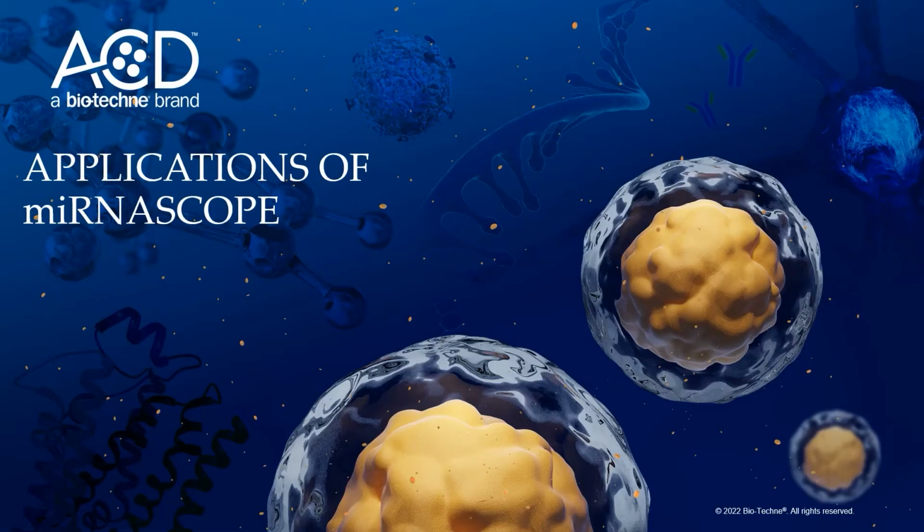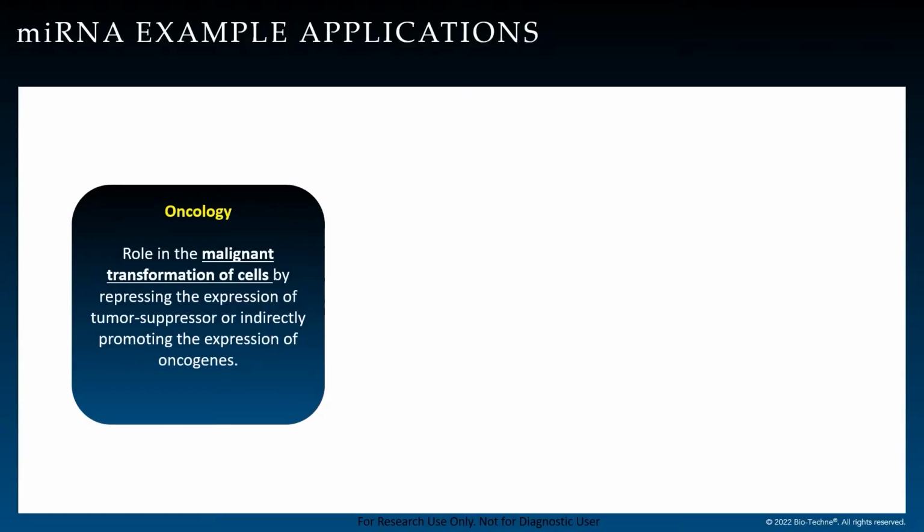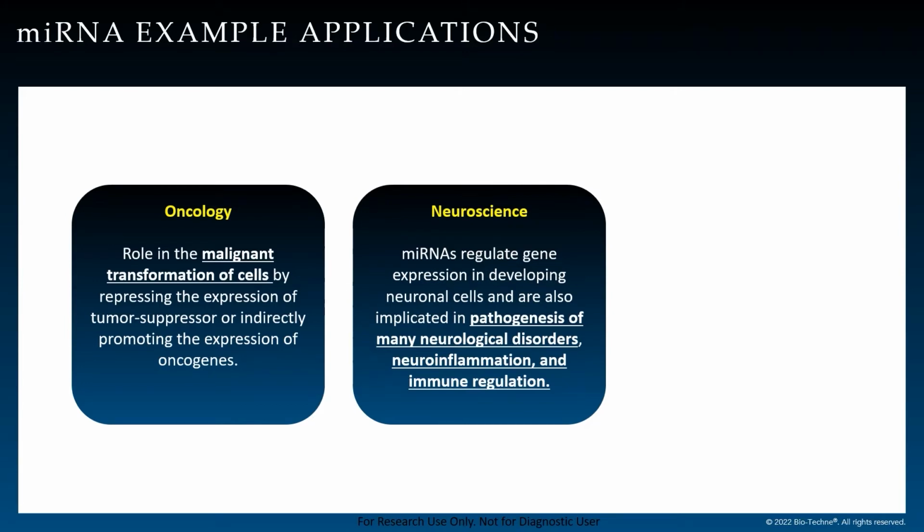Now we will discuss some applications of the miRNAscope assay. MicroRNAs can play a role in tumor formation by repressing the expression of tumor suppressor genes or indirectly promoting the expression of oncogenes. In neuroscience, microRNAs regulate gene expression during neuronal development.